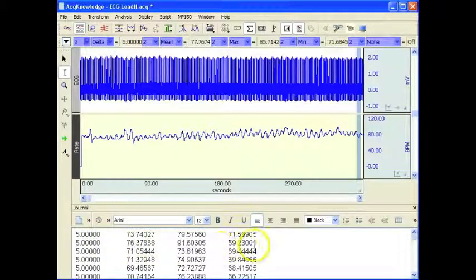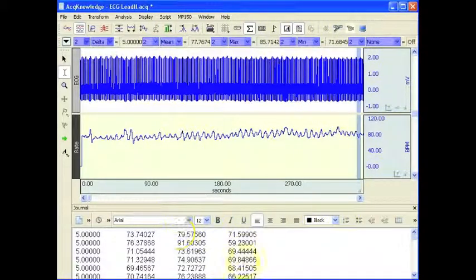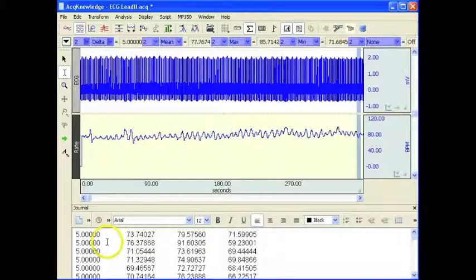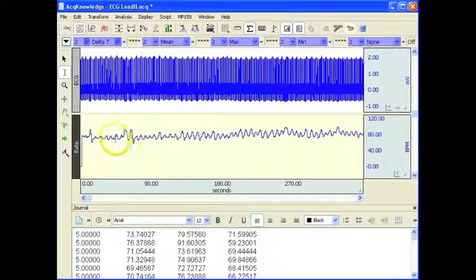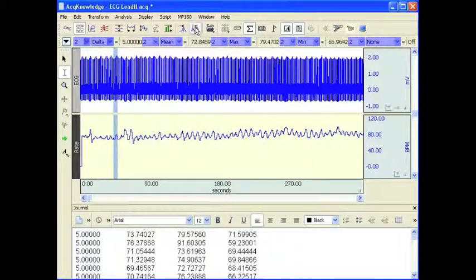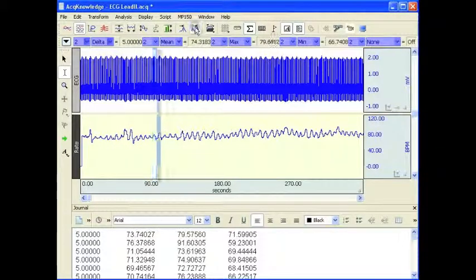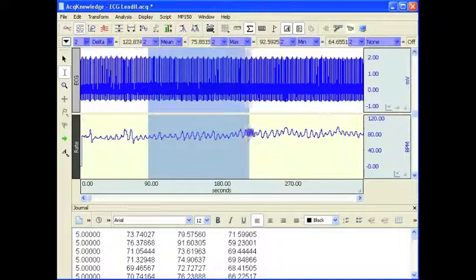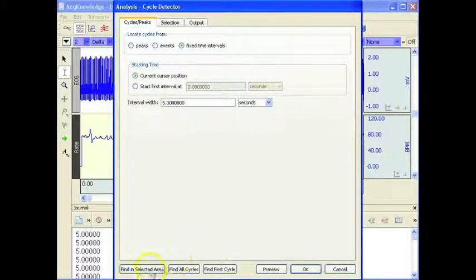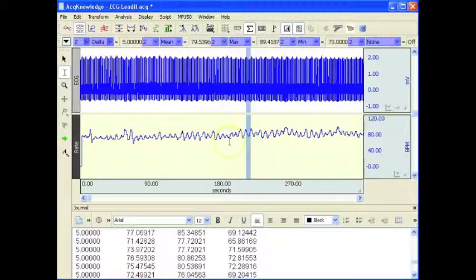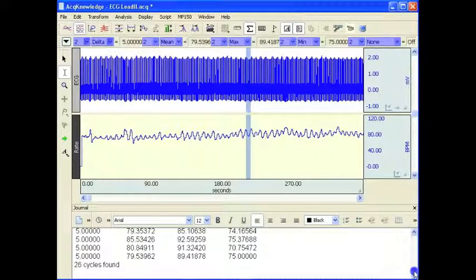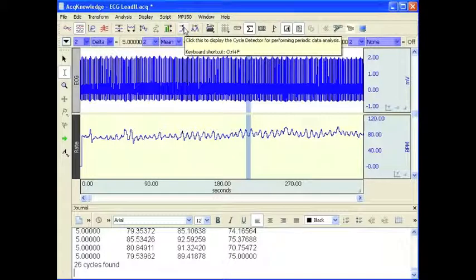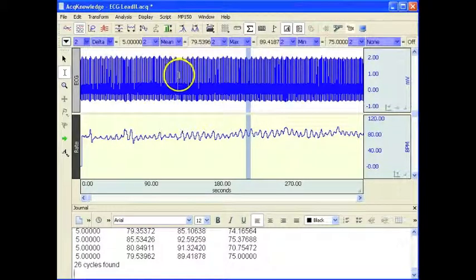You can turn the labels on and off so that it fits into the journal a little better. Obviously, we're looking at a very condensed window here for the purposes of the screencast. If we were working on a regular size window, you'd have plenty of room for units and labels. We can manually advance the system through, just to make sure we are taking measurements at the appropriate places. Or we can highlight an area and find in the selected area. The software just found the events in that particular portion of data — it found 26 five-second intervals in that selected area. That concludes this demonstration of the Find Cycle peak detector.